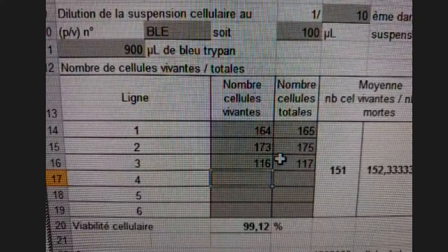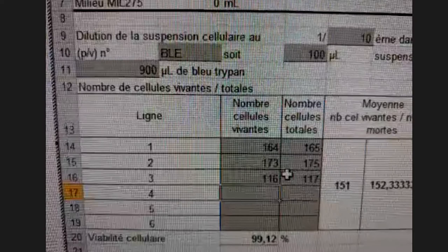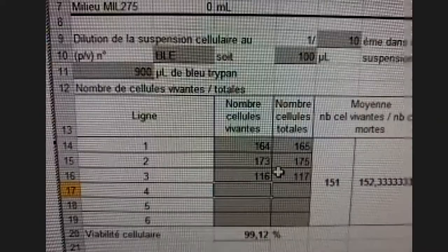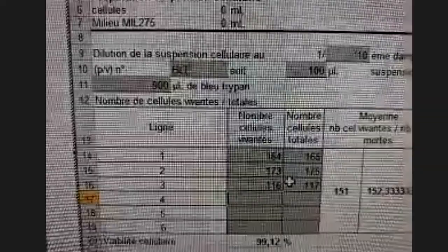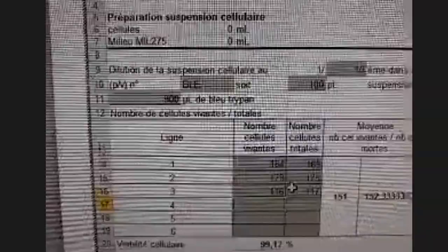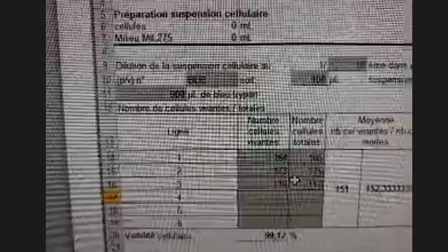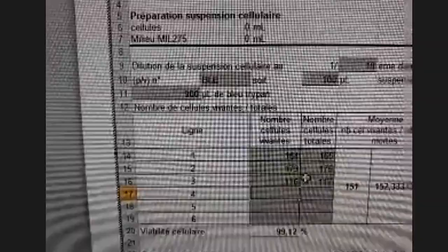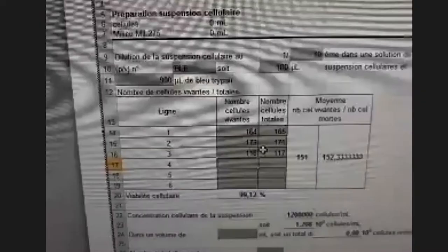You should verify that the number of cells obtained in each rectangle is close to the other numbers, to ensure you have a homogeneous repartition of cells within the hemocytometer.